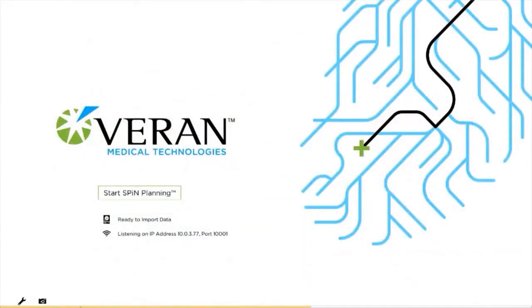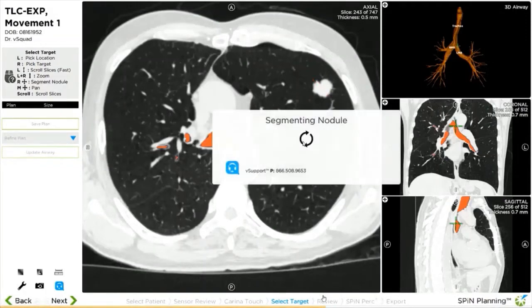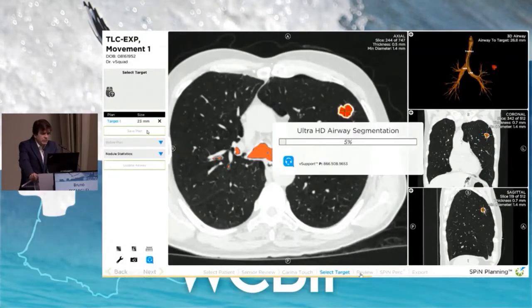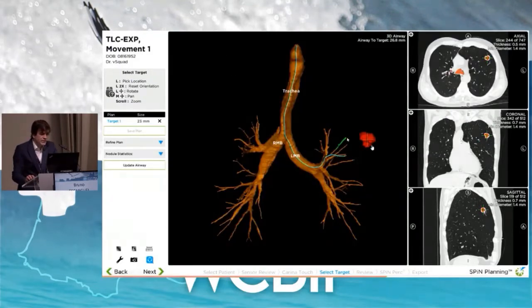The technology is really easy, and now the pack is included with Vera and Olympus. Okay, so it's a technique that uses the DICOM of the CT scan. Then you fix where is the abnormality, and there is an artificial intelligence that gives you all the lesion in surface and volume, and then it calculates automatically the segmentation, and gives you a pathway. But you have the possibility to change the pathway, or to select another zone. For example, if you have 2 nodules, you can select 2 different nodules, and now you can follow the different ways. For example, here there is a limitation because there is no bronchus way. And you can, after the processing, follow the pathway like a line.